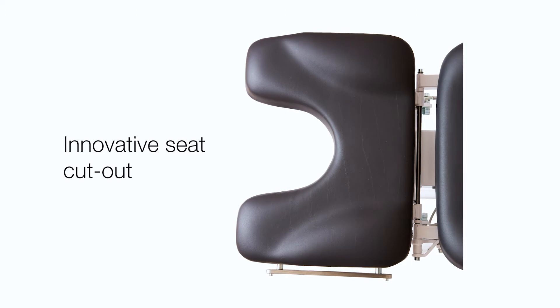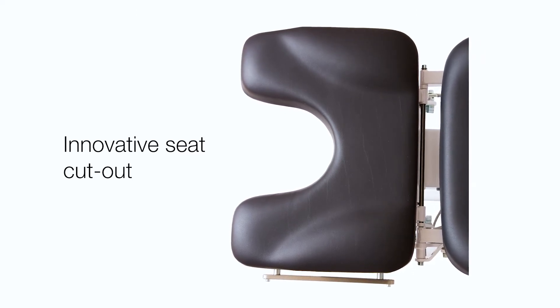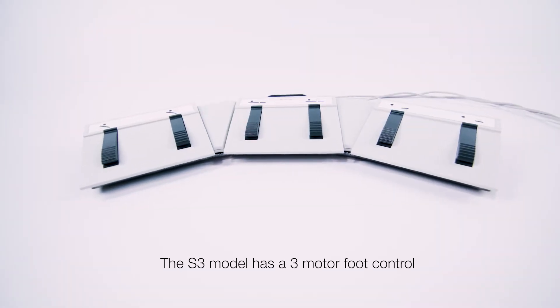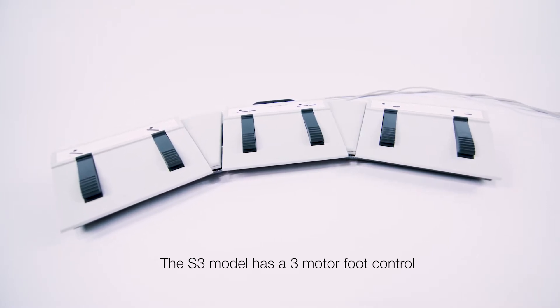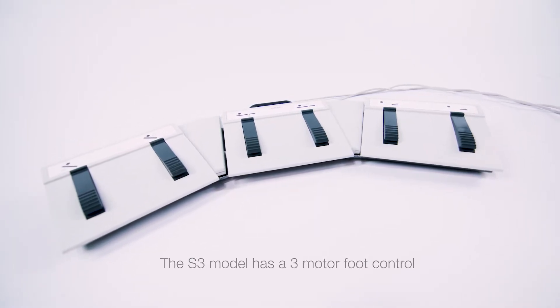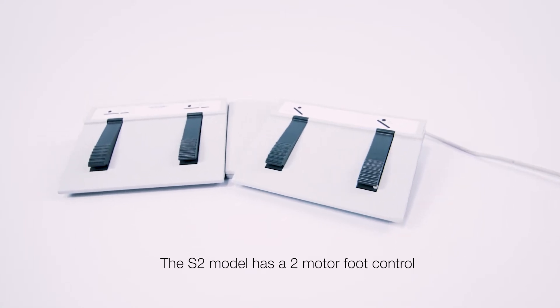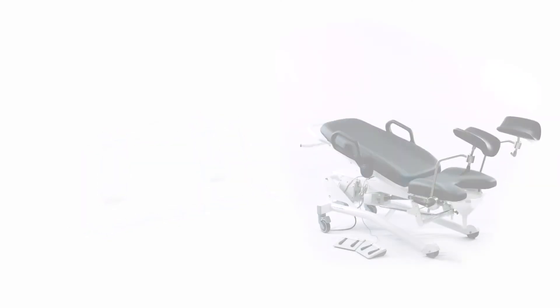The innovative seat cutout allows patients to void while seated, and the entirety of the procedure can be conducted with the patient in the chair. The S3 has a three motor foot control, allowing the clinician to easily adjust patient positioning with the height, back, and seat angle motors. The S2 also allows the clinician to easily maneuver patients with two motor foot control.